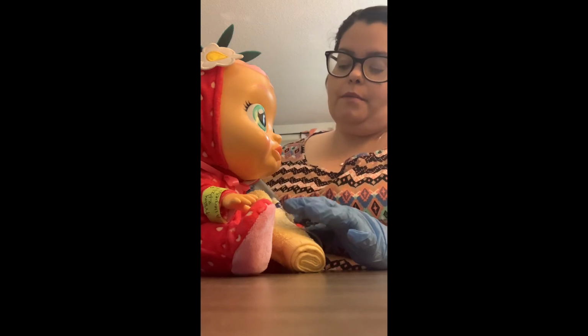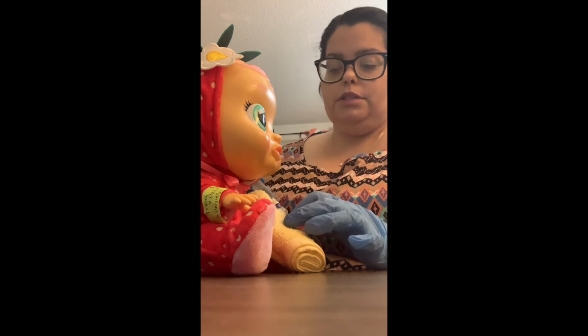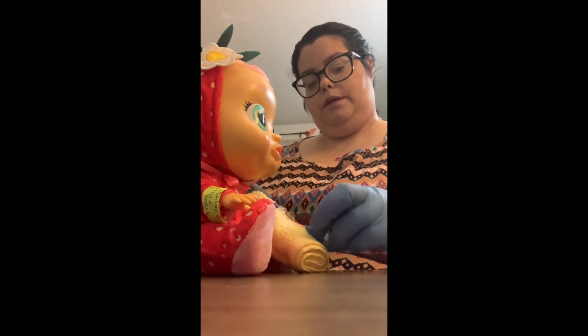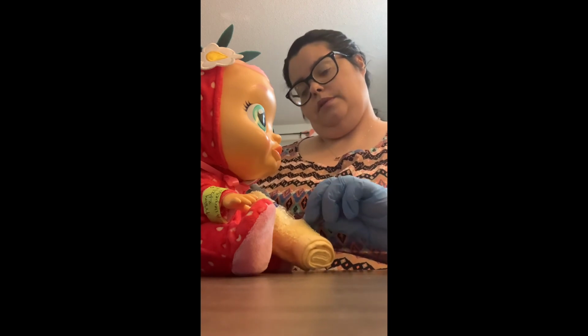Once we have pushed in the rest of the medication with our flush, we can proceed and flush it. Once we have flushed, we want to make sure we clamp our line. So we are creating the lock.